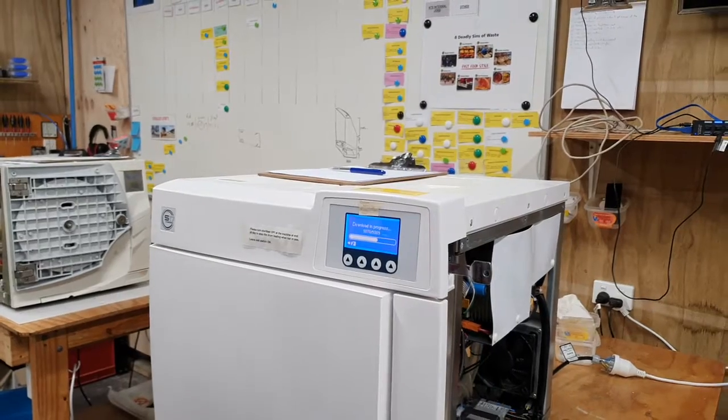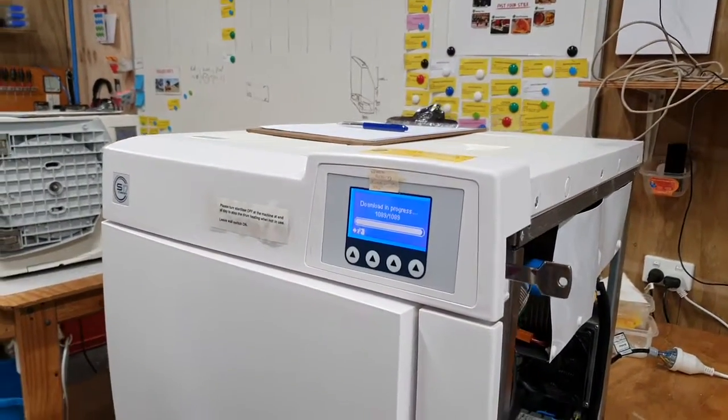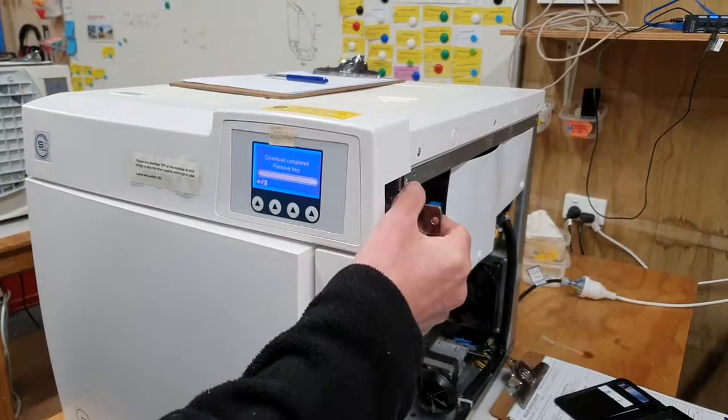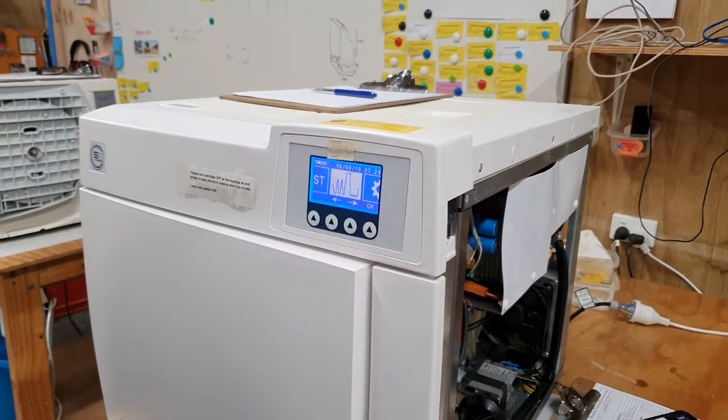We'll just pause the video here, and we'll just download the last cycle, and it says download complete, remove the key. So it's now safe to remove the key. Yep. Cool. And now we can download the cycles.